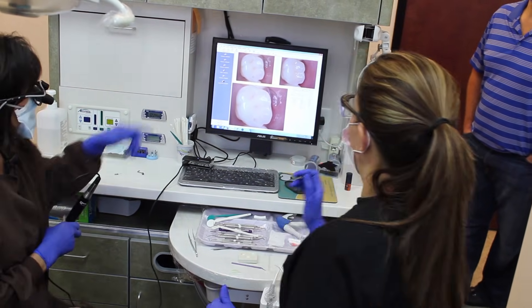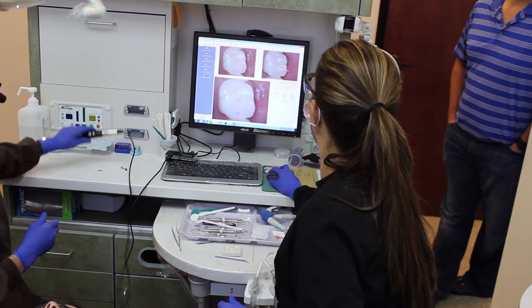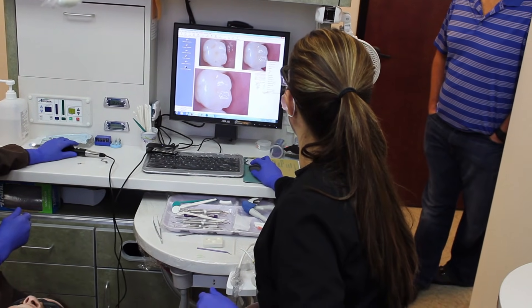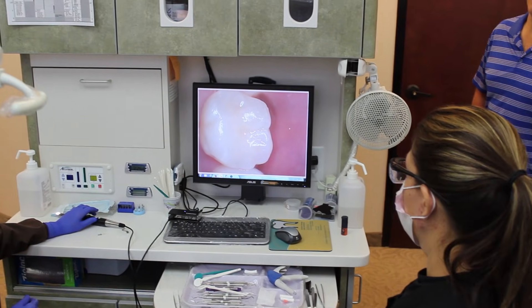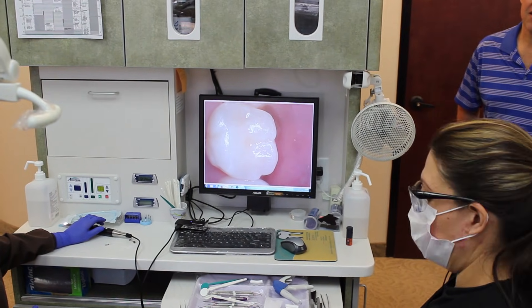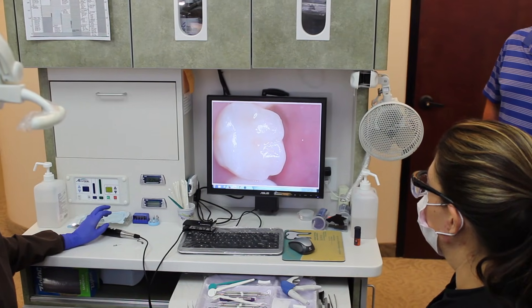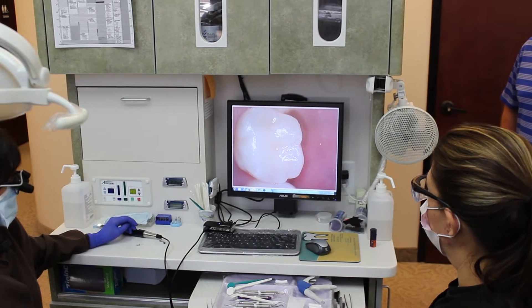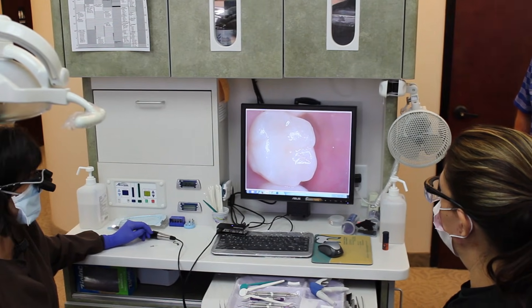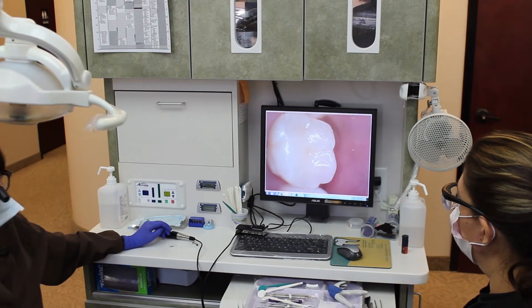And there we have it — let's enlarge it, put it full screen. You can see that the cavity is gone. It's a nice filling, blends into the tooth. And we did it all without a shot and without drilling. The only way you can do that is if you find cavities when they're small.